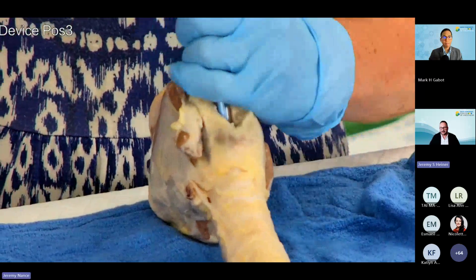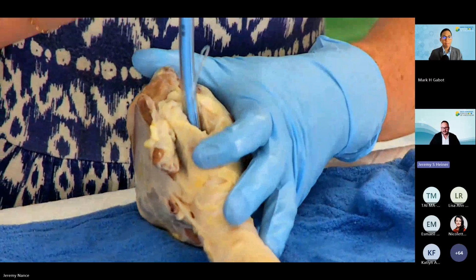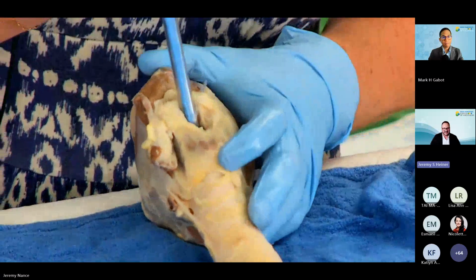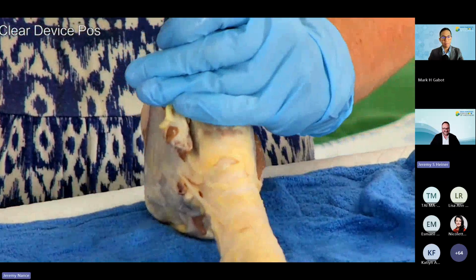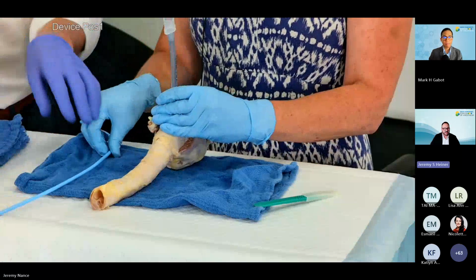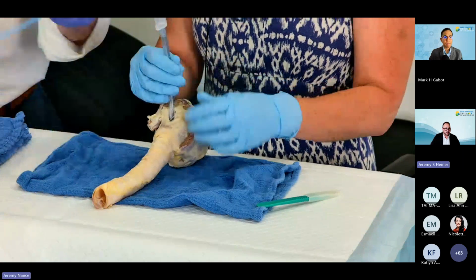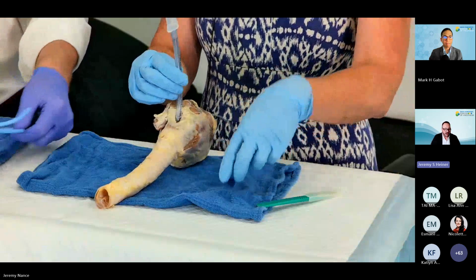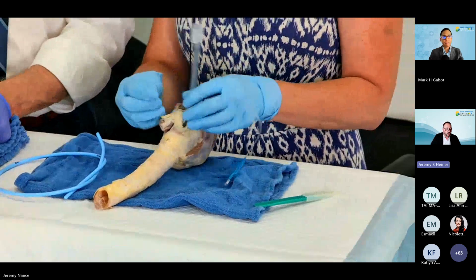So as I mentioned earlier, we're going to rely on our surgical colleagues to help us out once we've saved the patient's life here in this emergency situation. All right, so we're railroading. We're passing the endotracheal tube over the bougie. Remove the bougie. Now another thing is we're lower in the airway, so we don't have to go too far.